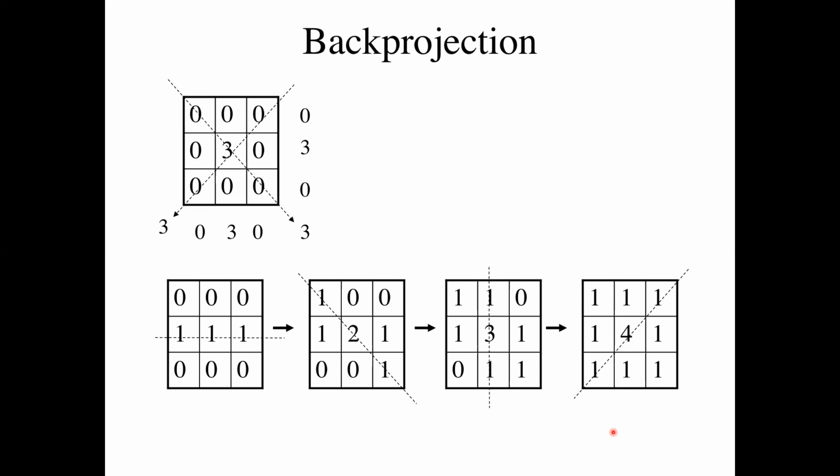So what you're describing, what you said is the insight is to, hey, why don't we do iterations? And we'll do an iterative reconstruction where I project my image guess and ask, does it match my data? When it doesn't, you make some correction and do it all again, right? And you just keep iterating until you get as close as you can to your raw data.